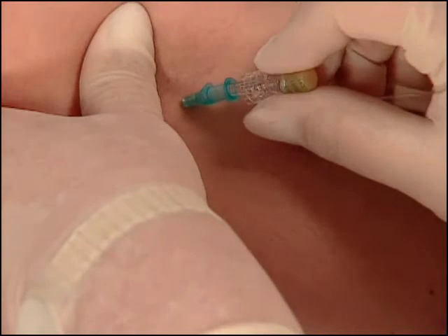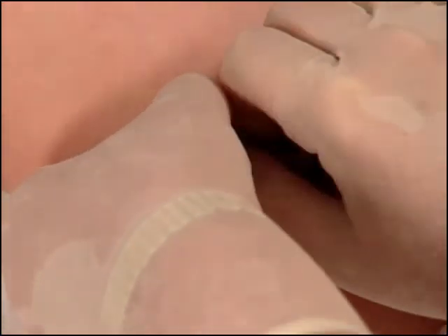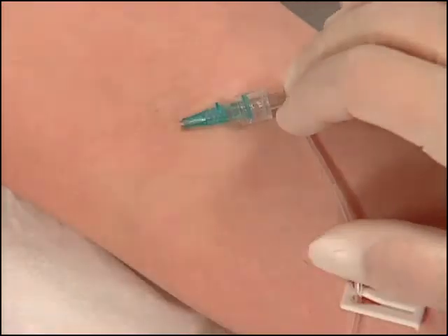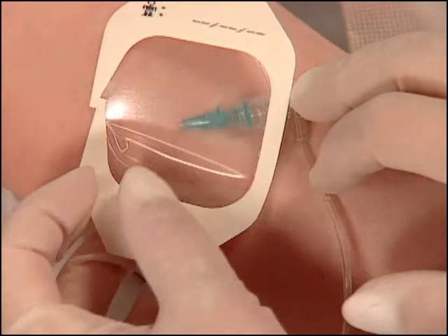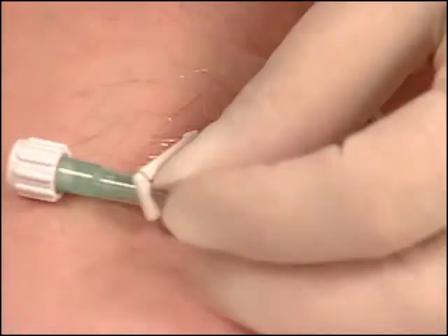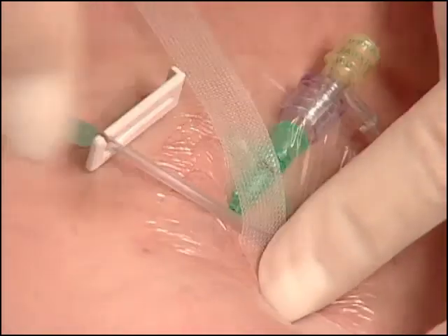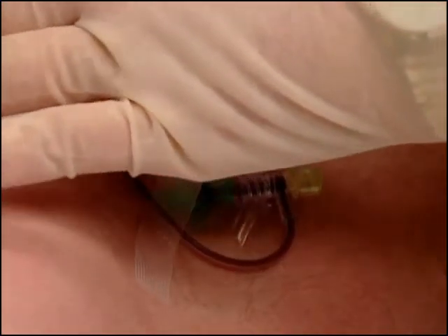Attach either the lock or the tubing from the fluid to the hub of the catheter. Be sure that whichever system is used, it has been appropriately flushed prior to attachment. Secure the catheter with an adhesive dressing. Since there are many methods used for securing catheters, follow the local protocols and procedures. Flush the lock to maintain patency.